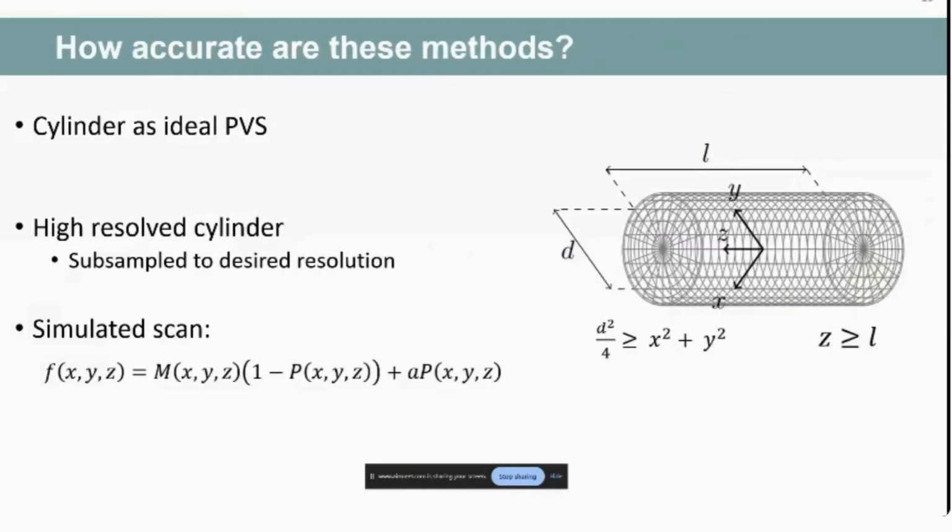So how can we validate these methods? When I started working on this project, the first thing we did was try to validate this. So I developed a model of perivascular spaces, looking firstly at a cylinder, and tried to add it to a simulated scan. This allowed me to play with the dimensions and see the limits of the filters we use.